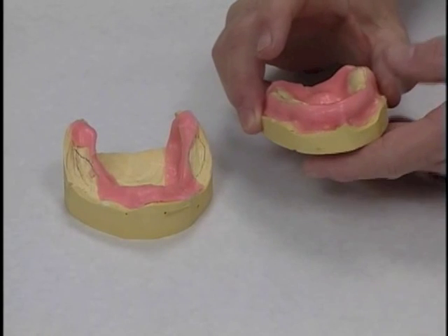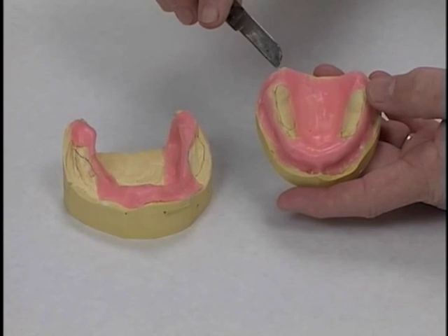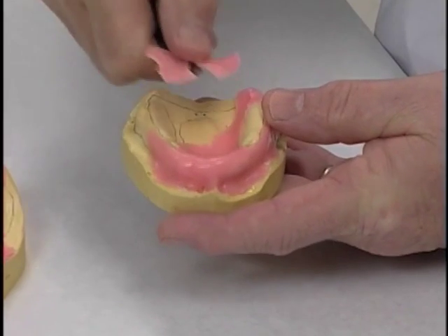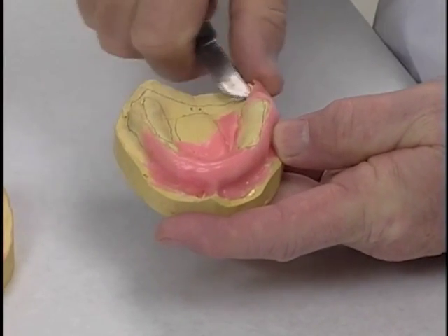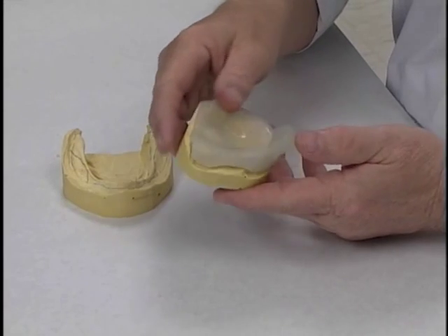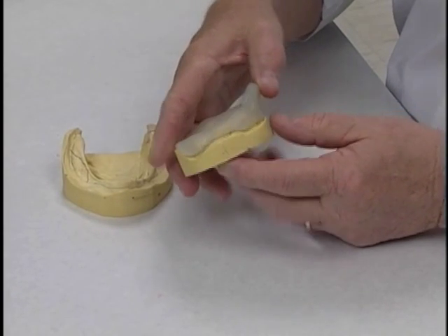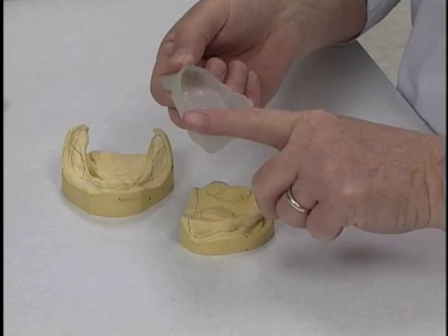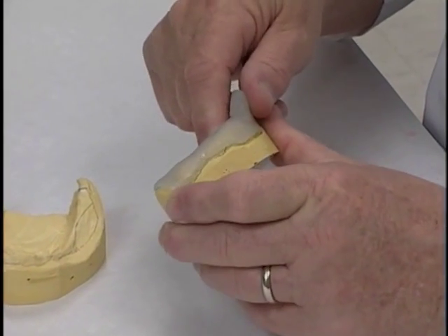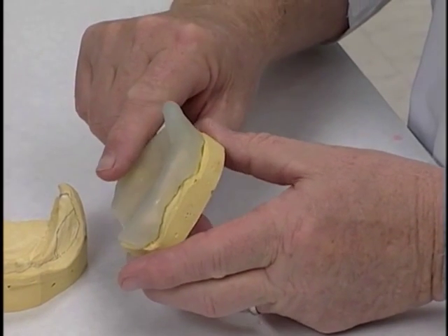After the trays have been cured, we need to remove the wax from each of these primary casts to get it back down to the point where all of our lines that we drew on these casts originally are exposed now so that we can see them. For the most part, we won't be very far off with this one. We'll just need a little trimming here and there to smooth the peripheries, because the peripheries are quite rough at this point, and we need to round off and smooth those peripheries and get them at the original length where we intended those peripheries to go.